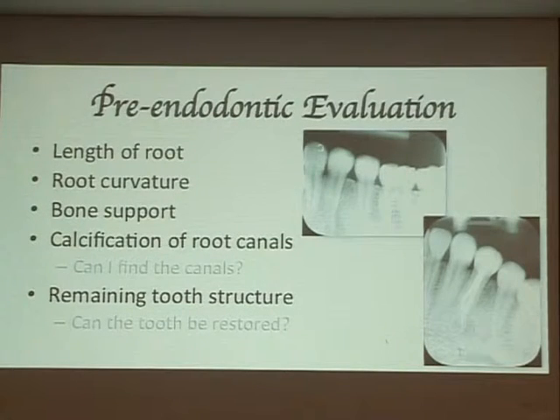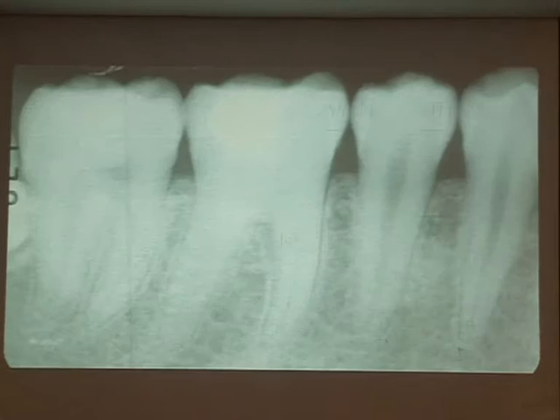In fact, this is a 3-rooted lower premolar. I look at this case. A young patient came to me. I don't want to do it, okay? Because you can't see the pulp. I'm sorry about the LCD projector, but we hardly see the pulp.